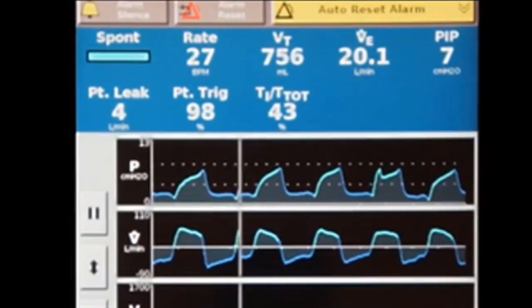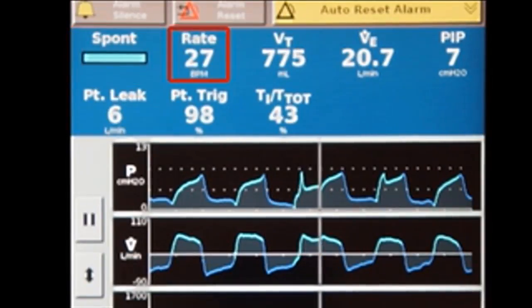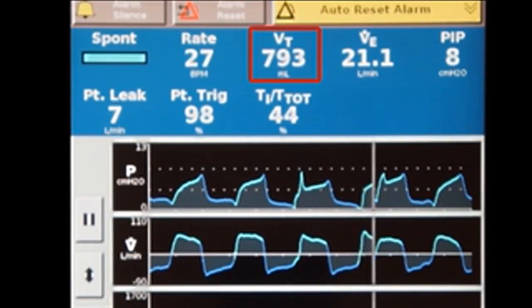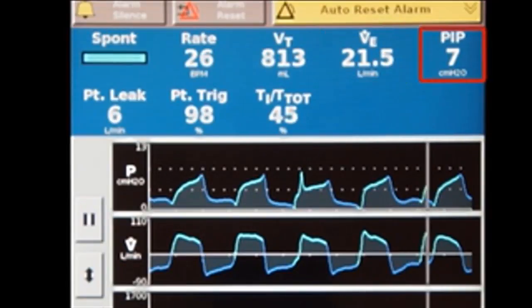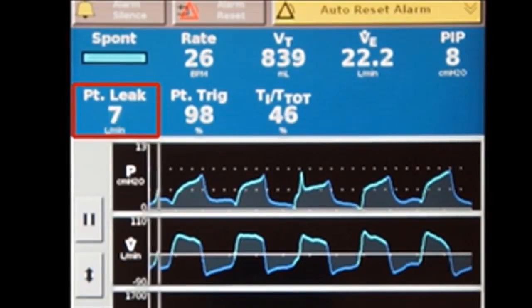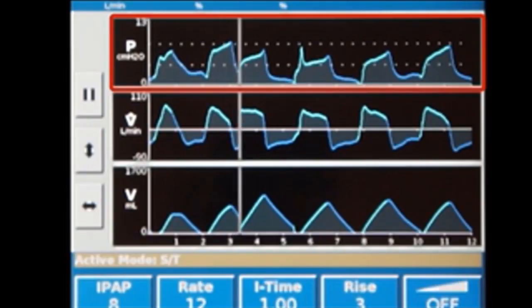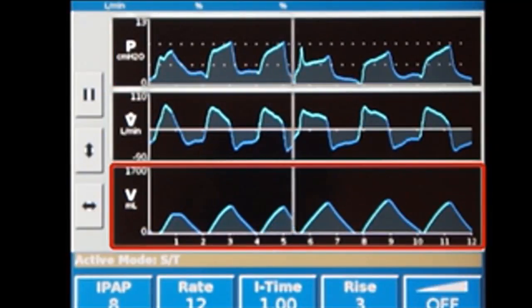The data in the top panel include the phase of the respiratory cycle, respiratory rate, tidal volume, minute ventilation, peak inspiratory pressure, and volume of air leak. The graphs indicate airway pressure, air flow, and tidal volume over time.